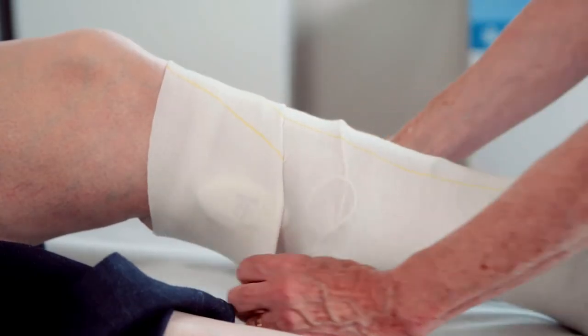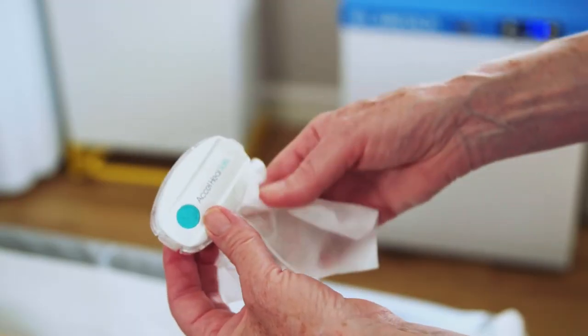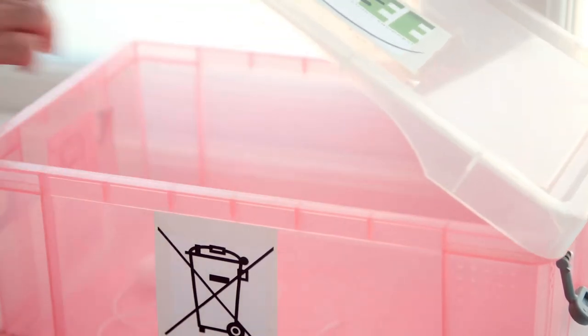Each Axel Heal treatment device runs for the full 12-day treatment, after which time it will switch off automatically. The dressing and bandages can be changed according to clinical need and local policy. The device needs to be disposed of in a WEEE recycling facility.